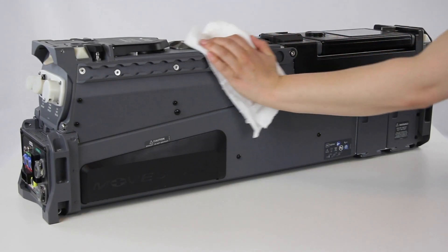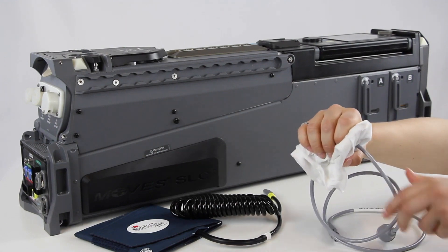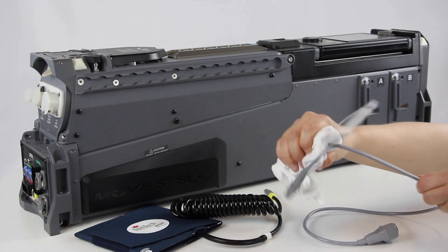To clean the device, simply wipe down the external surfaces. Cables, non-invasive blood pressure cuffs and tubing can be cleaned with disinfecting spray.